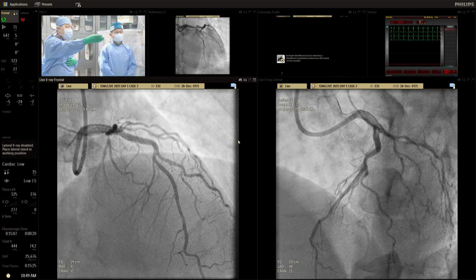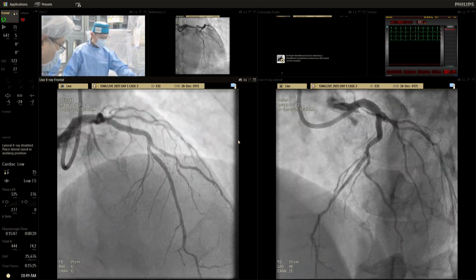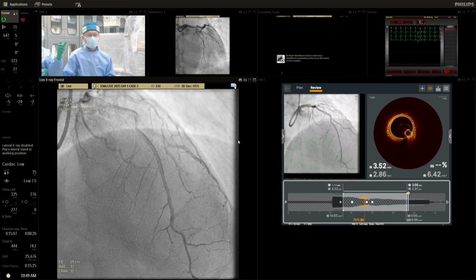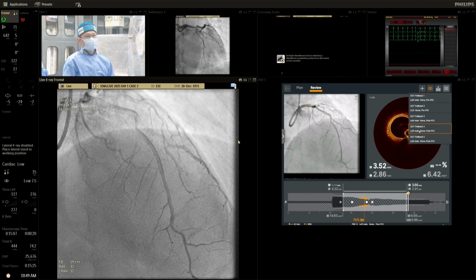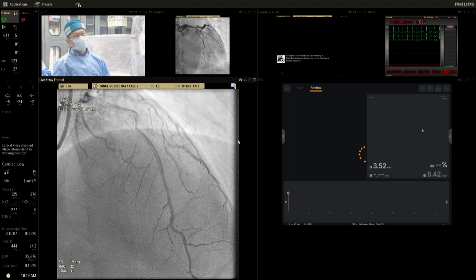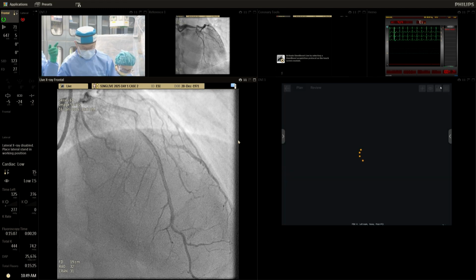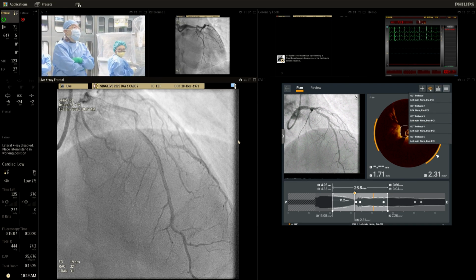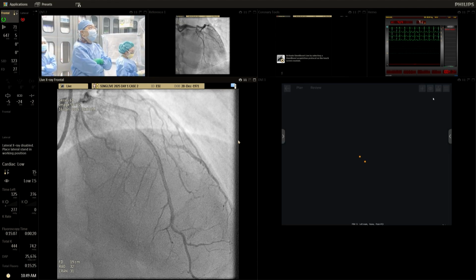Yeah, correct. OCT run. We haven't shown the post-dilatation one, right? Yeah, pre-stent. Pullback one. One more. Number three. I'll need to go to the computer. Number three. Pullback number three. No, number one. Number one. Okay. Can you show how to change the threshold for the orange?